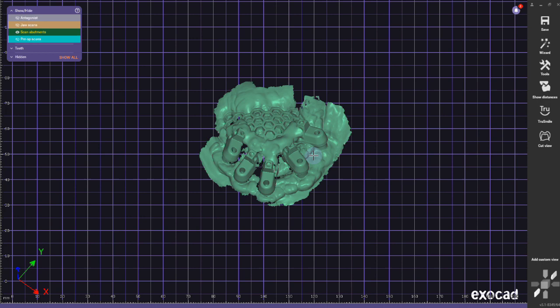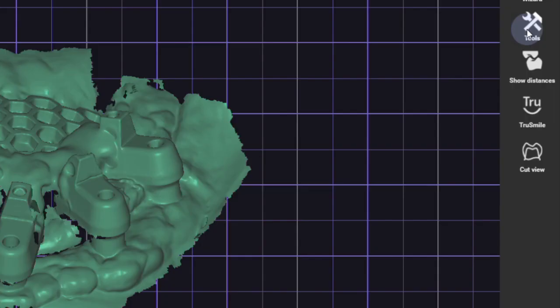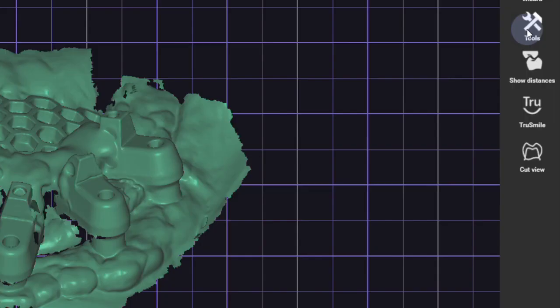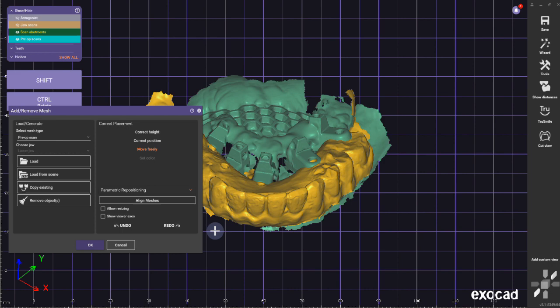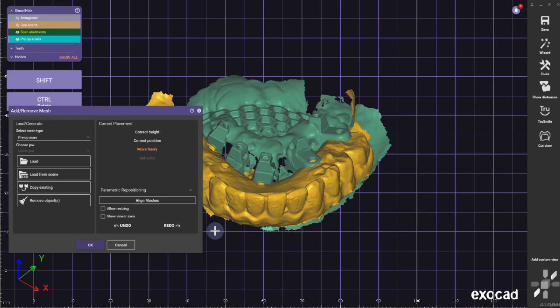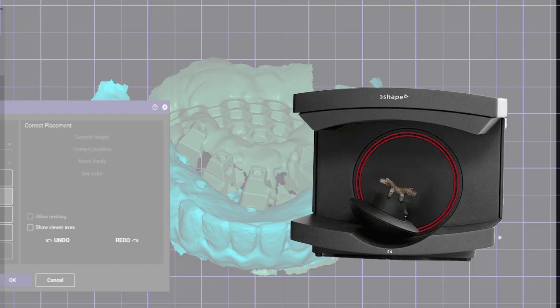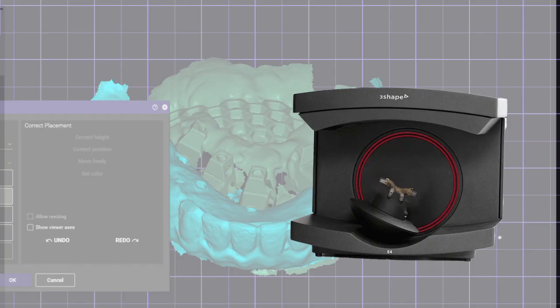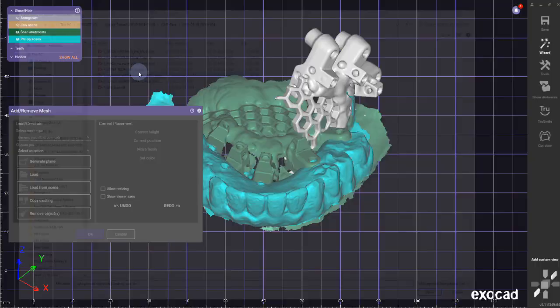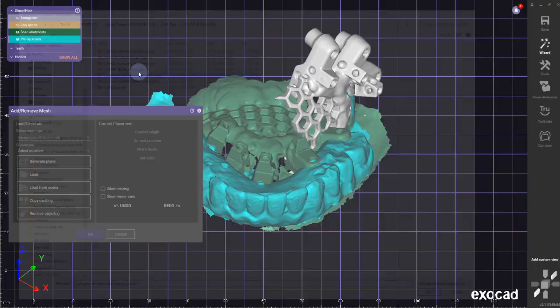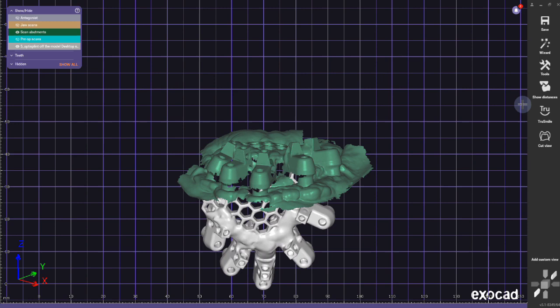This is an IOS scan. If you would align your scan bodies or your references to this, that doesn't work. So you have to take this opti-splint scan body scan and scan it in your desktop scanner. An intraoral scanner does not have enough accuracy, so I scanned it in a desktop scanner and I brought it in.